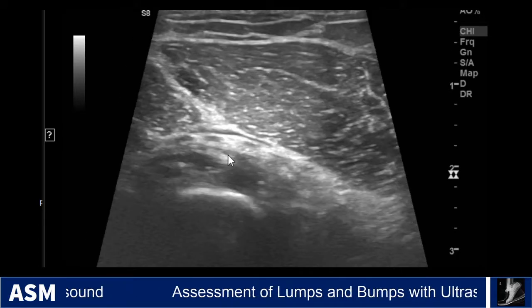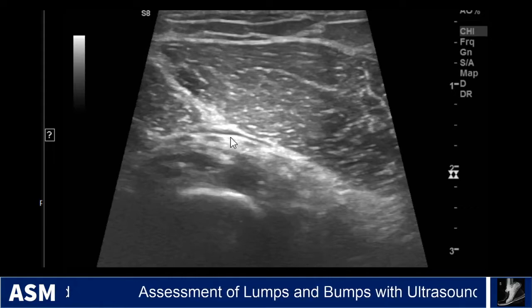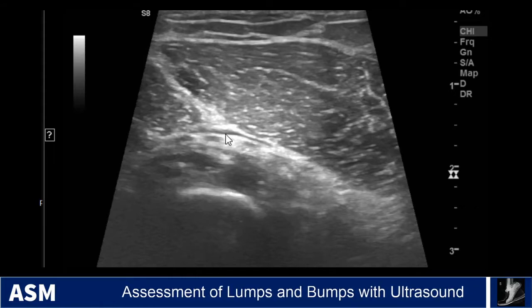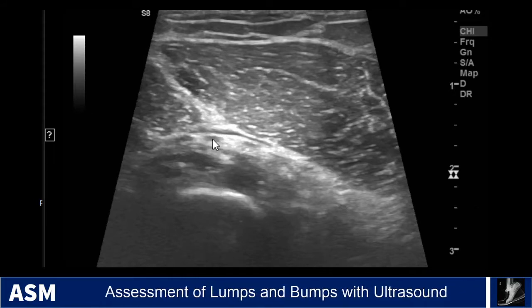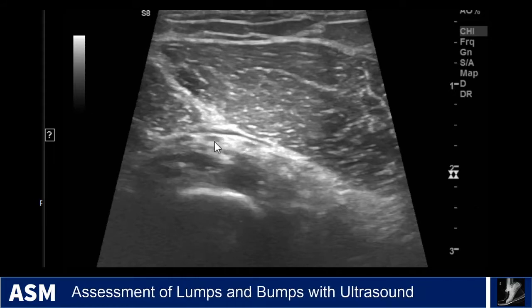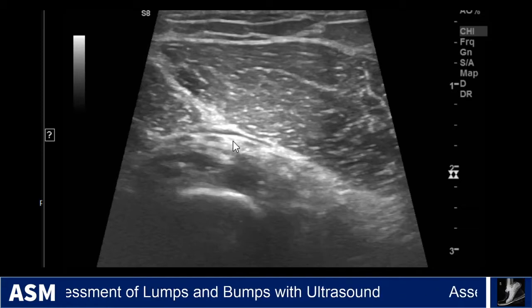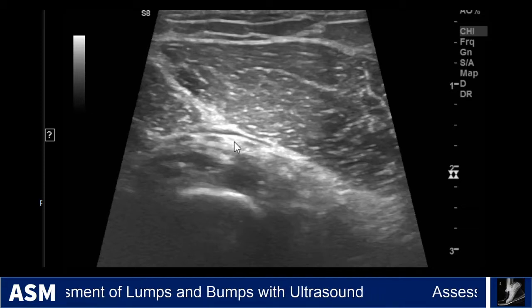Again the right side showing the deep head right up against the bone and a little bit of the superficial head, and we're starting to see the posterior interosseous nerve and vessels coming through between those heads.